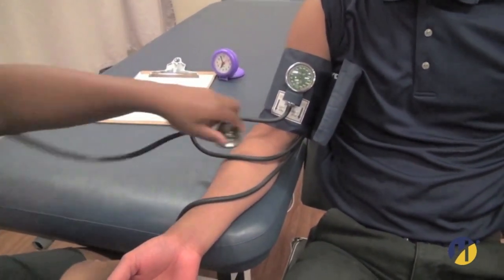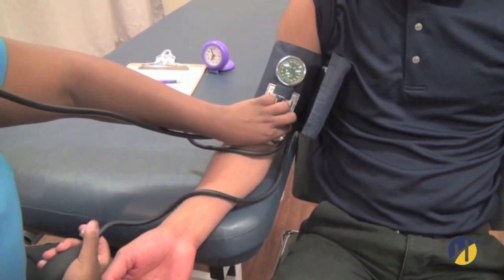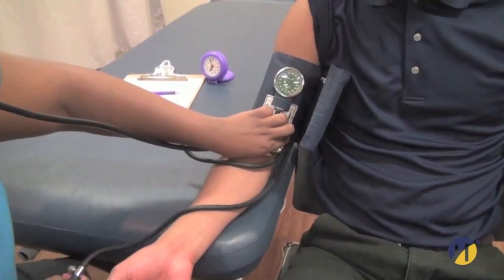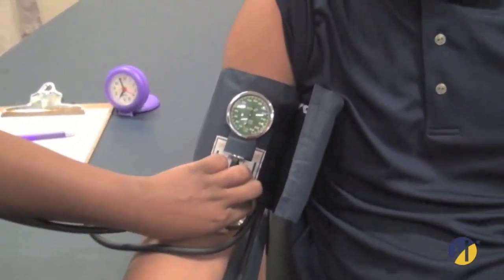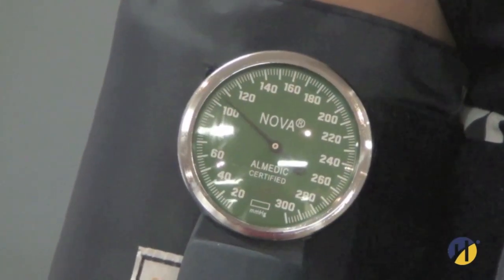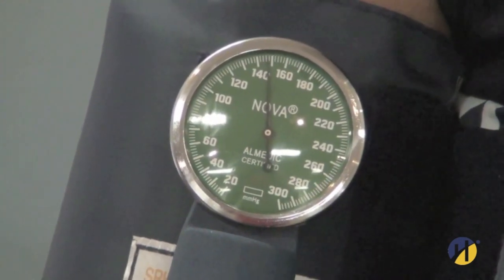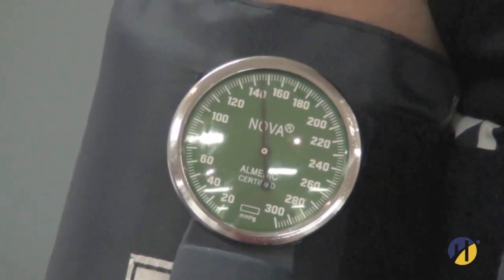Place the diaphragm of the stethoscope gently over the brachial artery. Increase the pressure rapidly to 30 mmHg above the level at which the radial pulse was extinguished. Open the control valve so the rate of deflation is approximately 2 to 3 mmHg per second, which is slow.